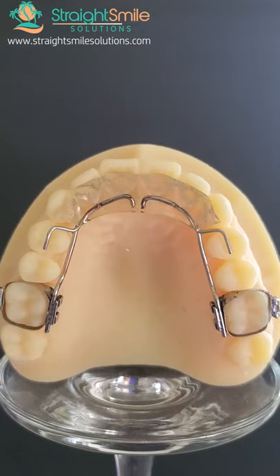You can have this made in a variety of different colors and shapes. This is a clear acrylic, but I always recommend that you let the patient have fun with it — pick a color, pick glitter. Let them own their appliance; they're going to be way more excited about it.